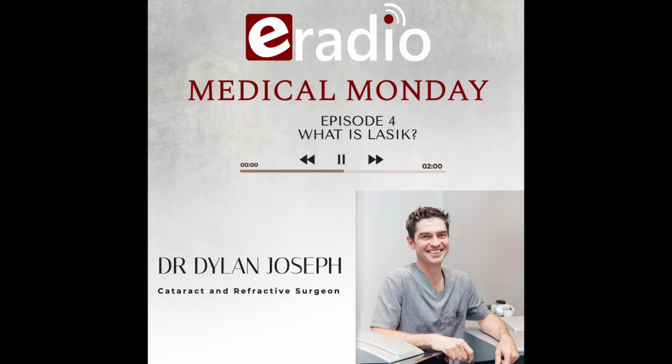And when we look back at keratomileusis, it basically means the reshaping. So we're using these laser pulses to actually reshape the cornea to allow the light rays to fall exactly where we want them to at the back of the eye. If you remember the session a couple of weeks ago talking about myopia and hyperopia and how we change the shape of the eye, either flattening in the center or steepening in the center to cause the light rays to fall either forward or behind that point that we're targeting. That's what the excited dimer laser does.